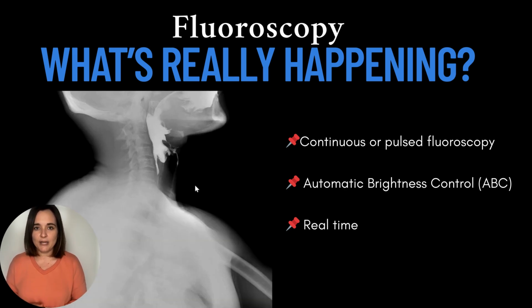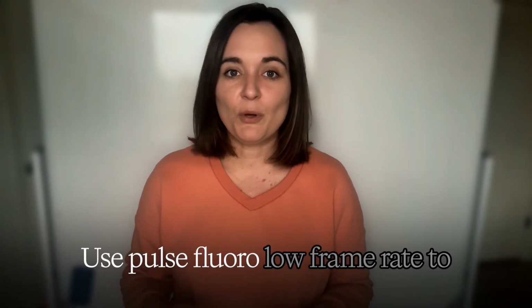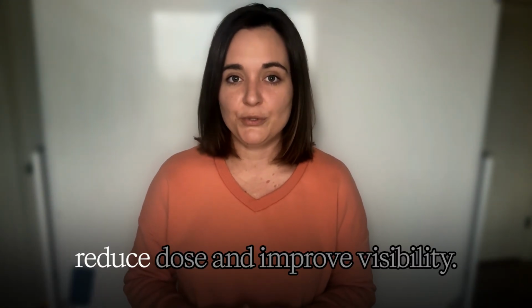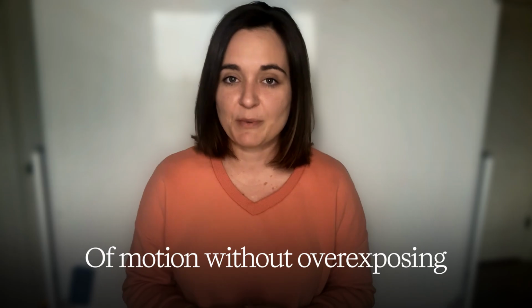Your automatic brightness control, ABC, is adjusting the exposure dynamically as contrast moves in and out of the field. Unlike static imaging, this means you need to think in real time, adjusting collimation, table height, and patient position as the exam unfolds. Here's a tip: use pulse fluoro, low frame rate, to reduce dose and improve visibility of motion without overexposing.